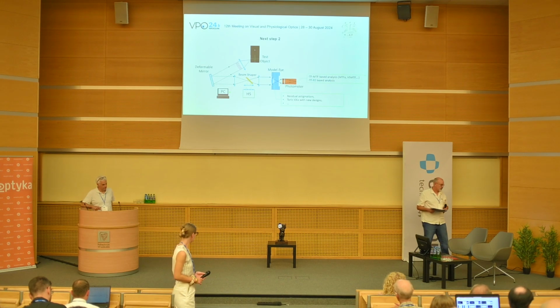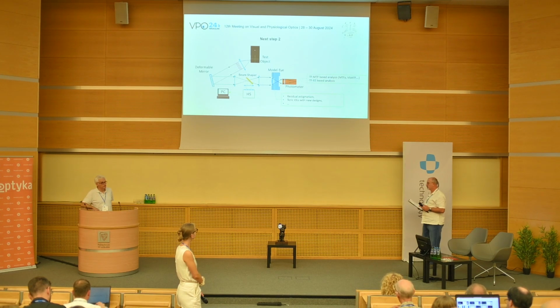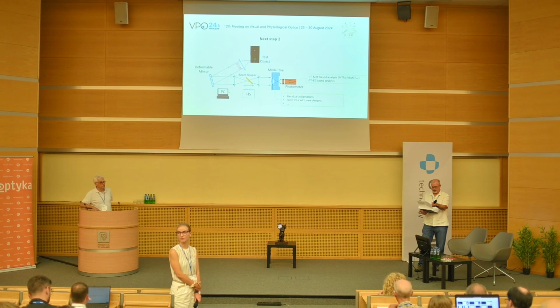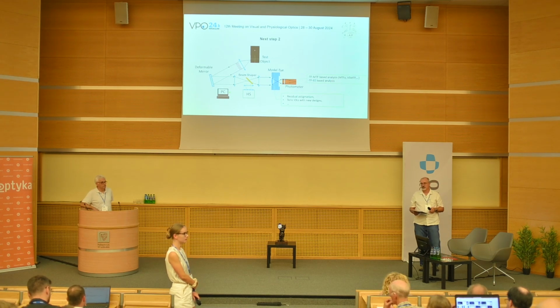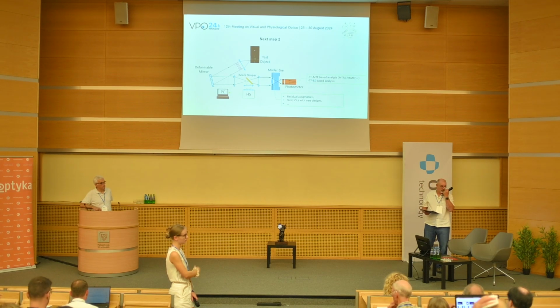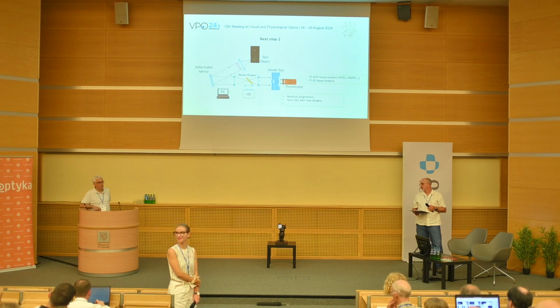I would go a little bit further and also go for a 3D representation rather than just looking at the vertical and horizontal axis, to actually look at, let's say, this VSOTF, but calculated as a volume rather than as an area. And I understand that for that you would need to measure aberrations, right? So I don't think with the photometer you can achieve that, right? Is that your particular reason why you're using just the horizontal and vertical axis, or is this also something that is common for ophthalmologists to understand, just two axes?